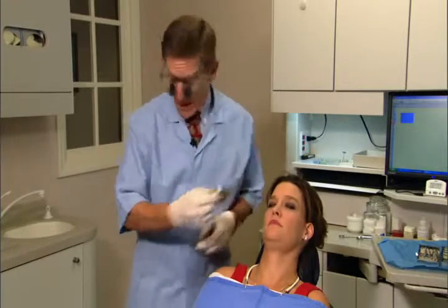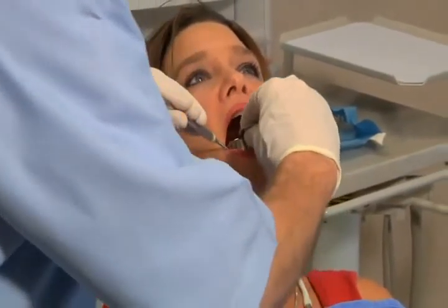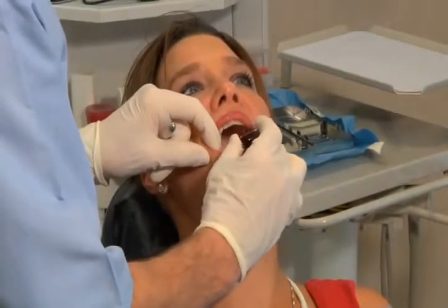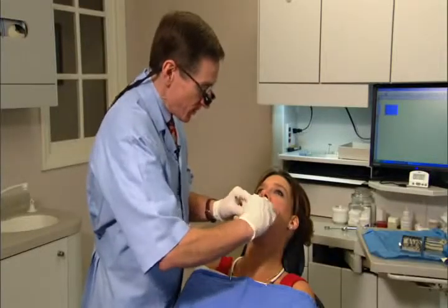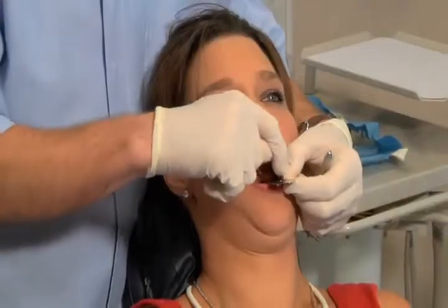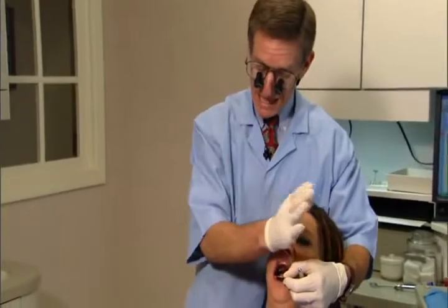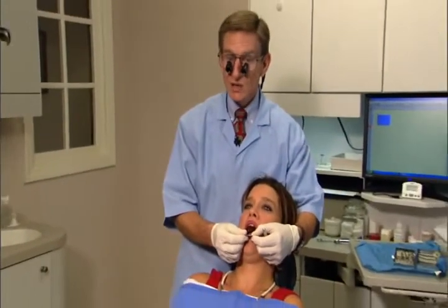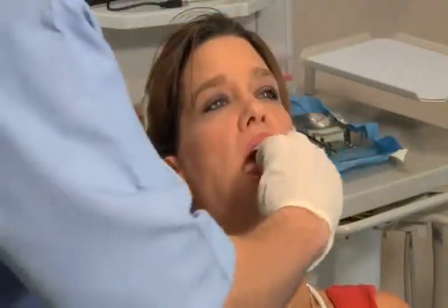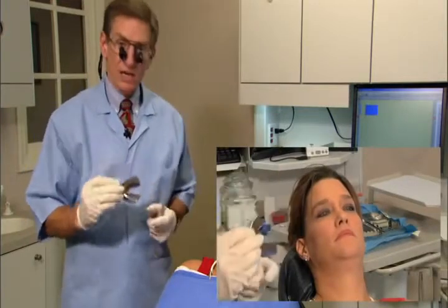We've performed an oral exam and tried the upper tray. Now we'll try the lower tray, practicing a little. I'll have her lift her tongue and relax it, then wiggle the tray around to check for banging into teeth. You want roughly equal thickness of alginate all around the tray. The hole at the end of the tray is the midline — use it as a midline gauge for the patient's face. A useful trick.